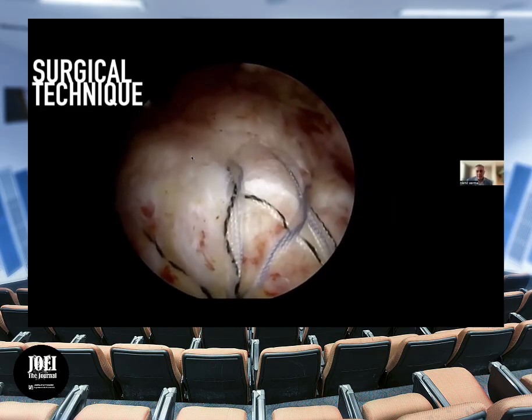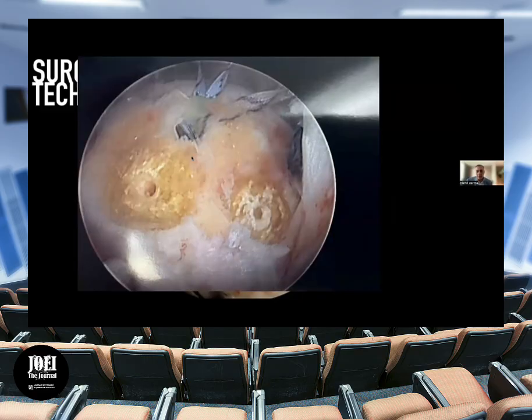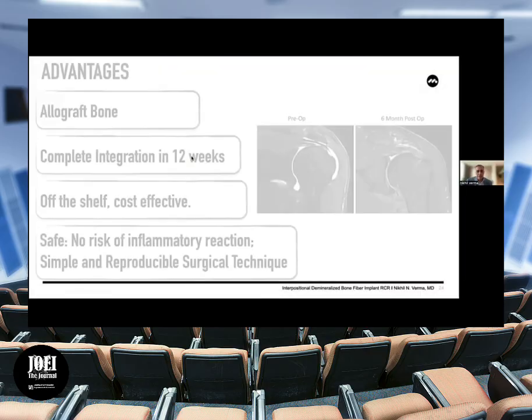But again, the implant sits in the interface between the tendon and bone, which is why we say that it flips the script in terms of conventional thinking from a rotator cuff procedure. And here's just an example of how, as tendon tears get bigger, the implants can be fashioned in a way that they can fit multiple different configurations or sizes of tears that you need.